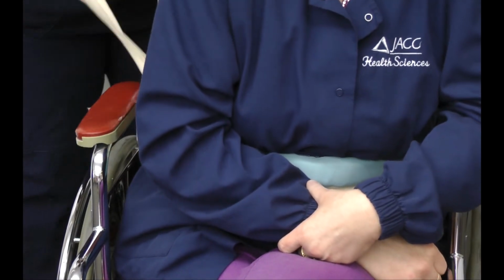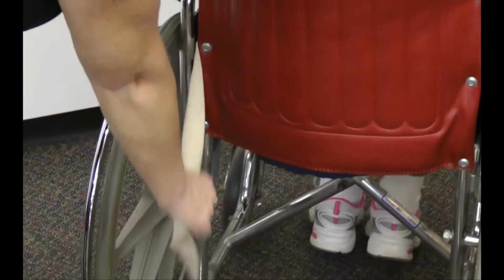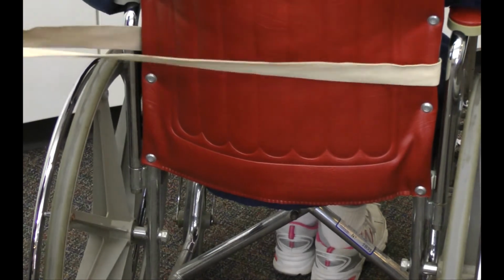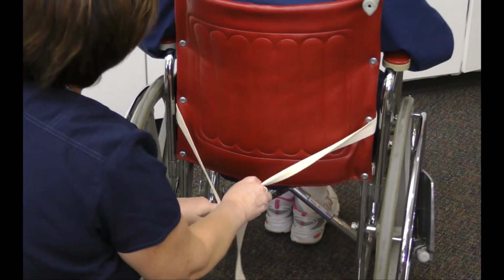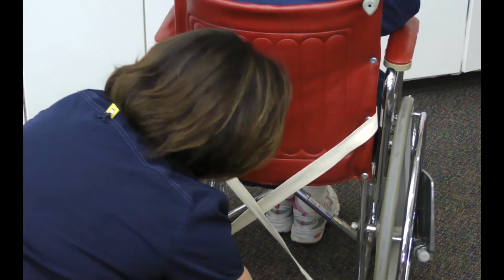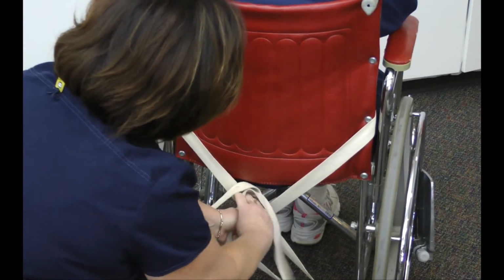And then Melissa, I'm gonna turn your wheelchair around so I can demonstrate. Thank you. How it comes right through the back here. Doesn't get tied to anything, okay? Not yet. What we have to do is, we have to get down here. Melissa, that's not too tight, is it? Go ahead and cross it right here. You bring it on the outside of the supports of the wheelchair. You bring it up here, and you have to tie a slip knot.